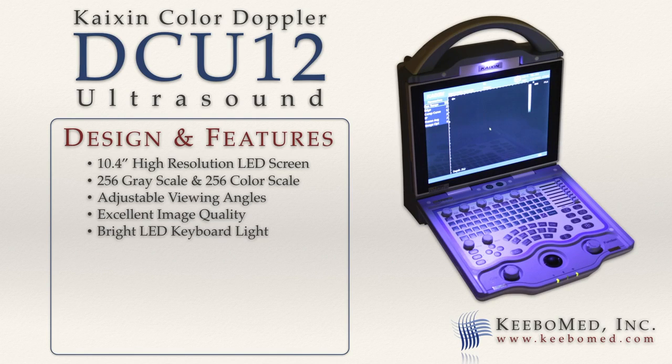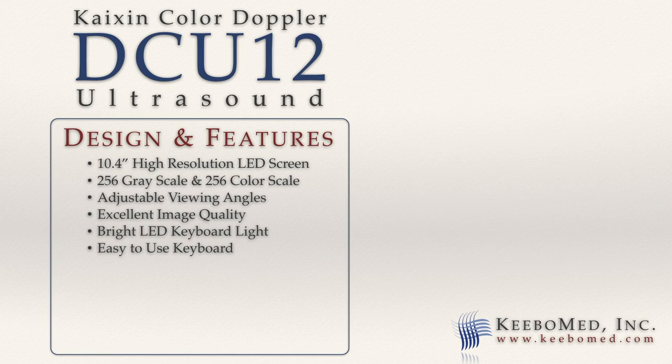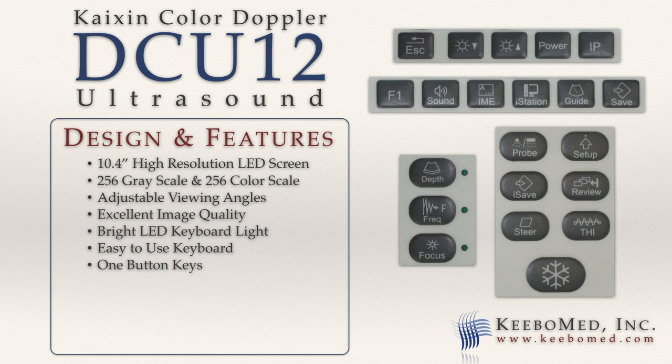A bright LED light allows for clear viewing of the keyboard in darker conditions. The keyboard is easy to use and includes multi-functional knobs for quick adjustments and many one-button keys including image storage, image review, and printing.